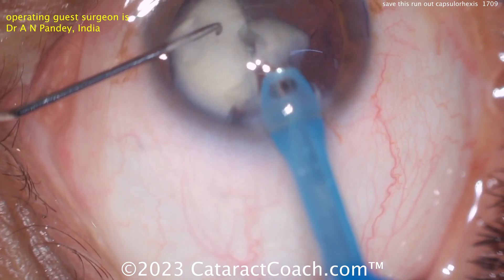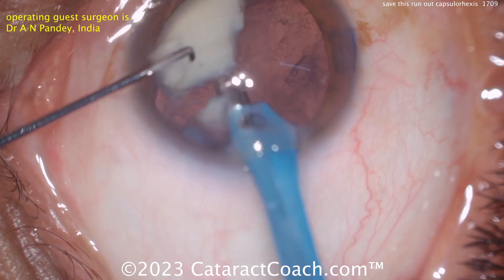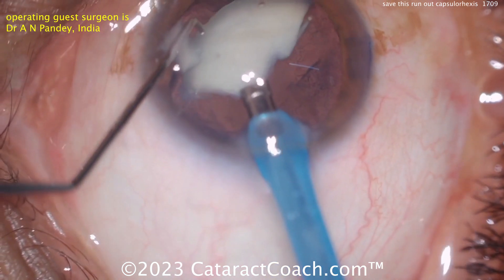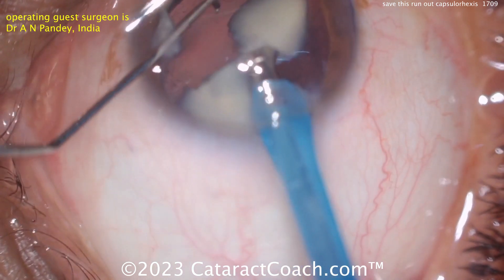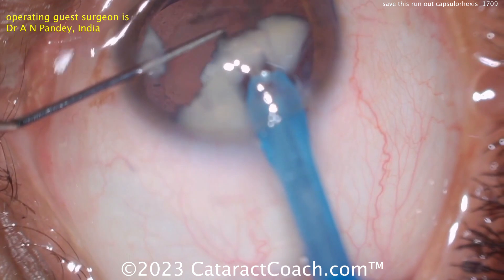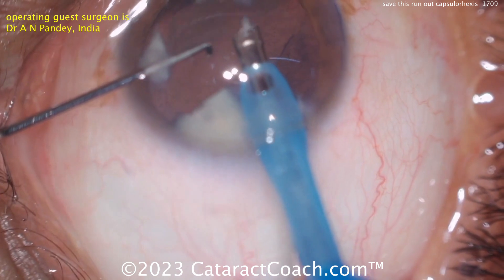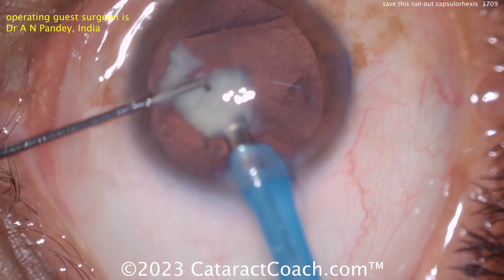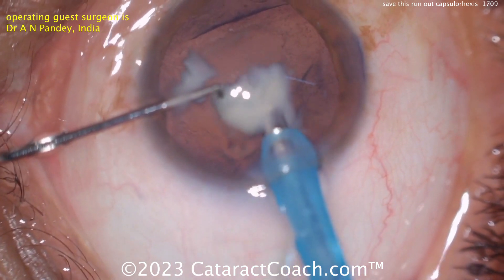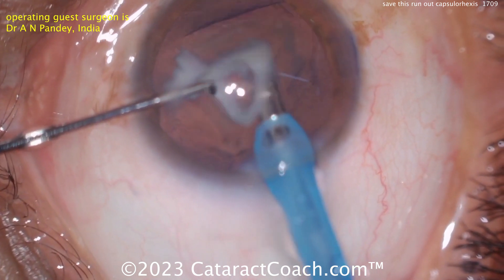Taking these last couple of pieces down. I'd look at that one area just to make sure. Once this last piece comes out of the eye, don't let the anterior chamber collapse — use your second hand to inject viscoelastic as you pull the probe out; keep the probe in position while you inject OVD. The capsule — miraculously — is still intact.